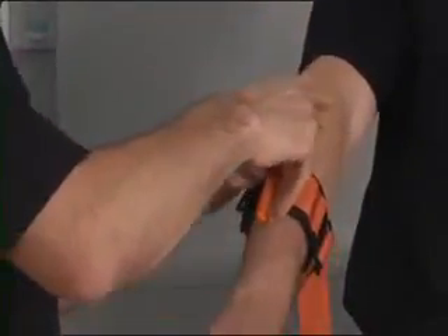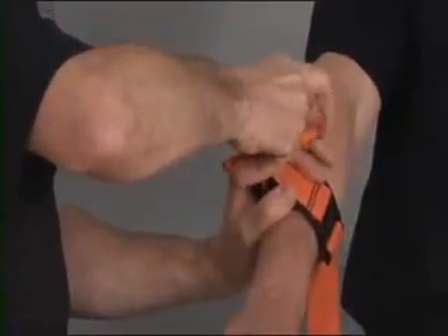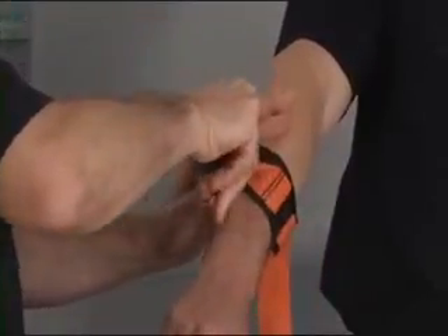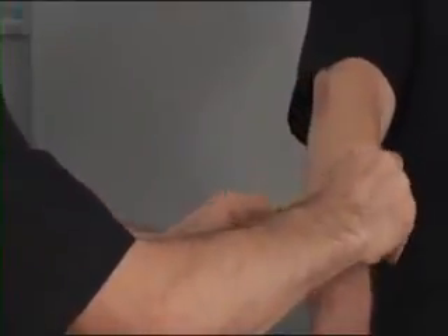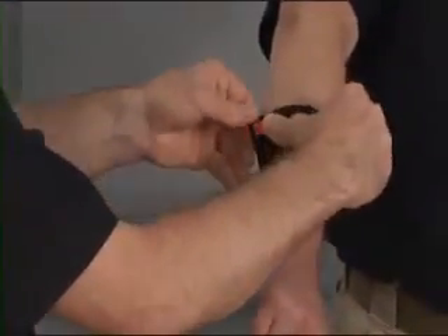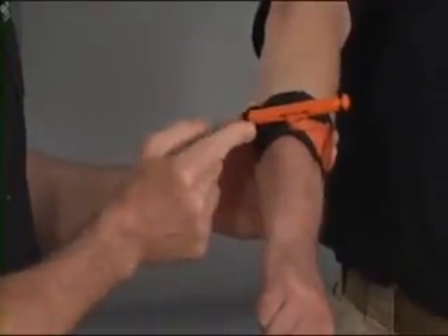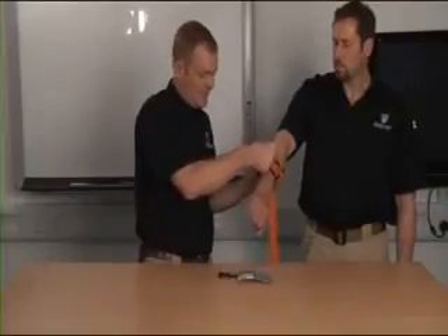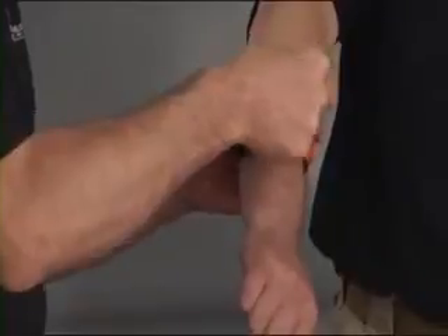I'm then going to pick up the metal bar just to take any further slack up from the system and avoid pinching, and then wind it up nice and tight until we have control of the bleeding. Having done that, I'm just going to put the metal bar through the plastic retaining loop and that will hold it securely in place. You can see this tourniquet is nice and firmly applied, and it is very robust and very unlikely to be knocked out.